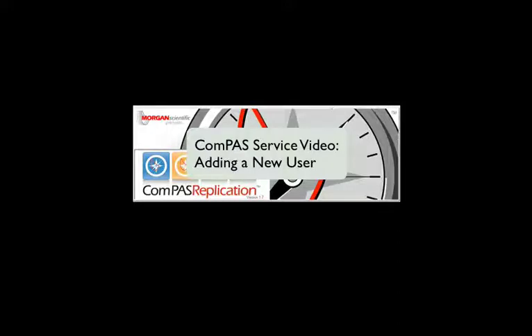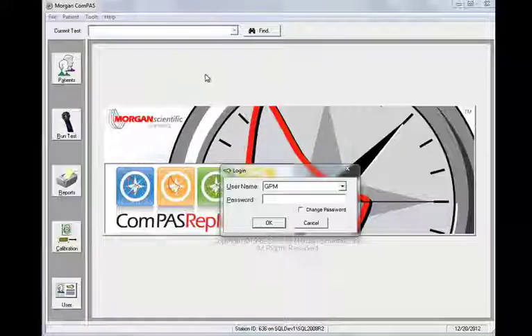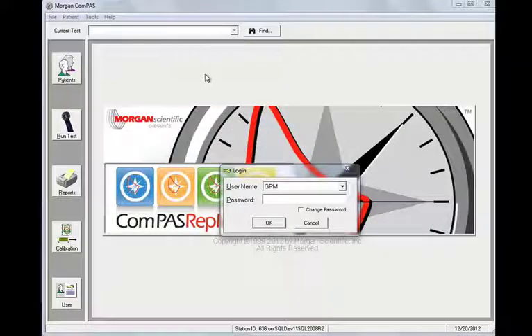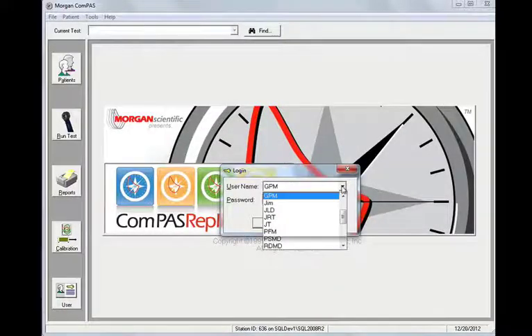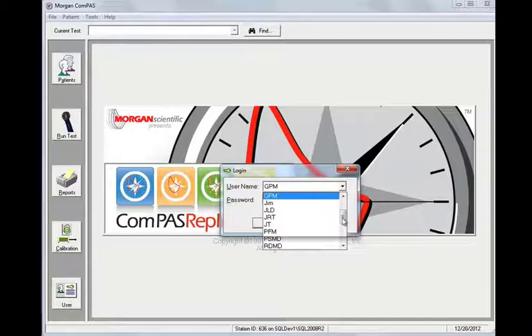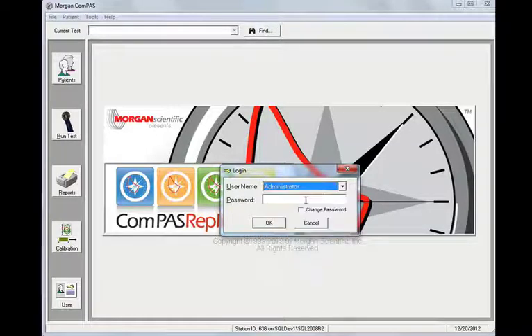Morgan Scientific Service Video: How to Add a New User. In order to add a new user, you need to log in with a username and password that has administrative privileges.